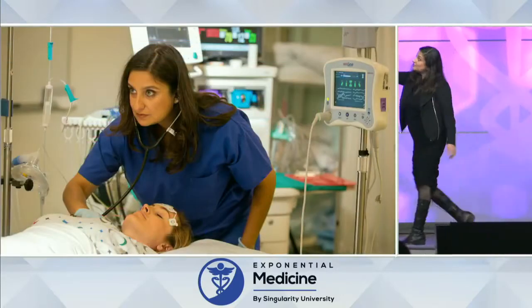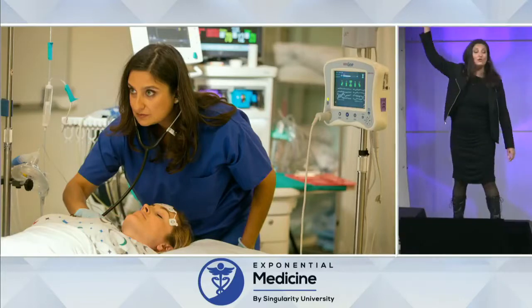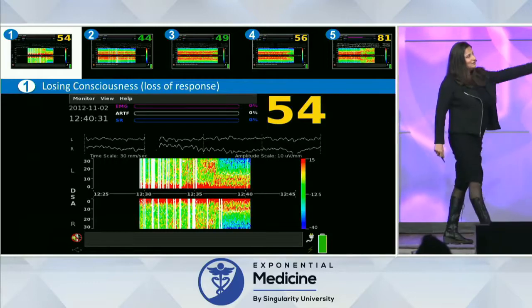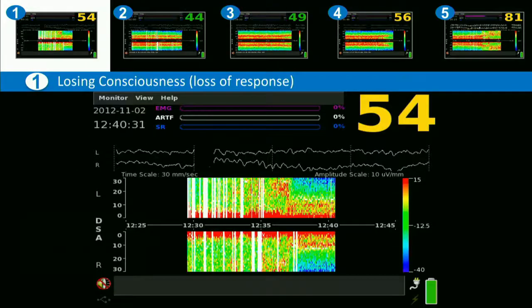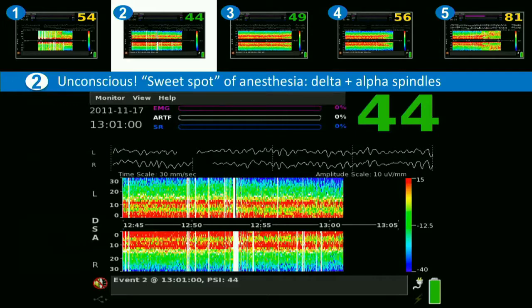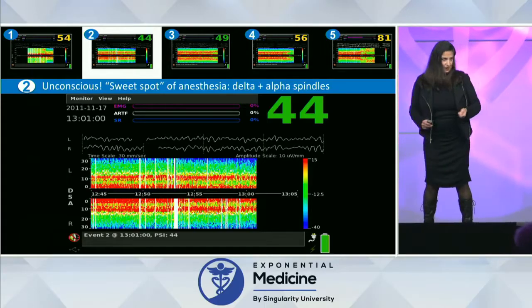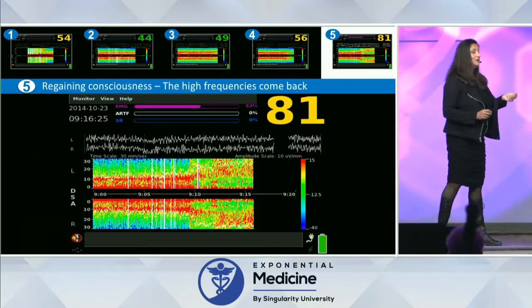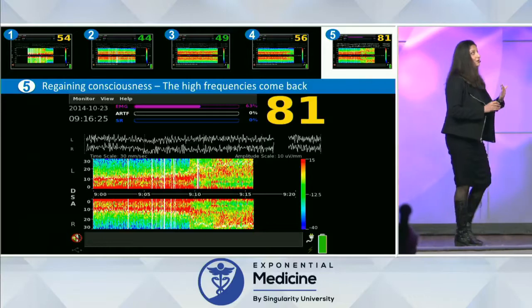You can actually see some real brain recordings over my left shoulder behind me in an operating room. And look at these photos here. You can actually track real patients' brains as they lose consciousness. You can see where everything goes from red and green to blue. You can track how to maintain them in this unconscious state so they don't feel the surgeon cutting into them and wake up during surgery. And then you can actually figure out how to bring them back.